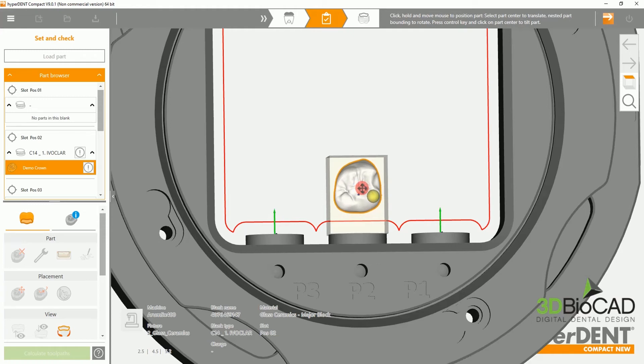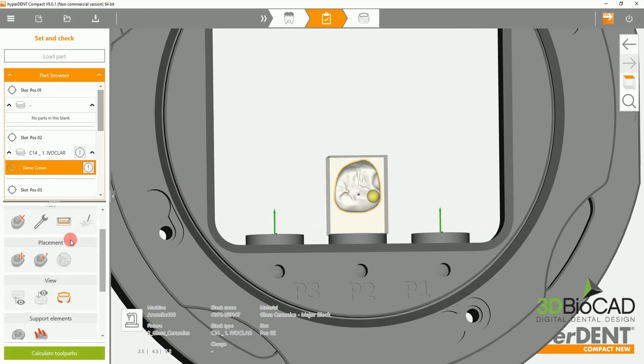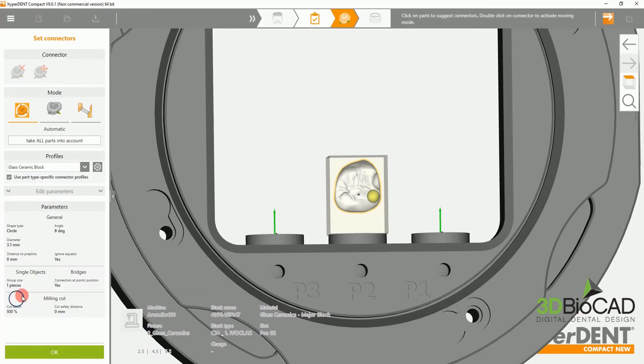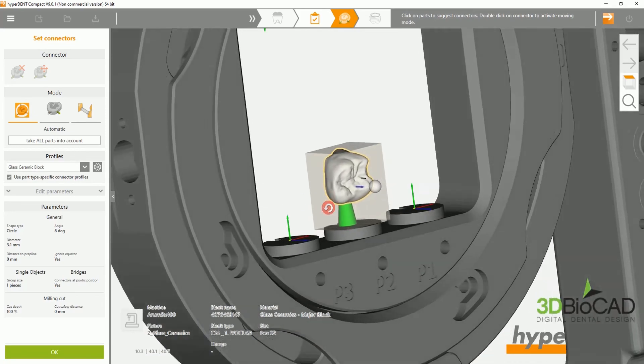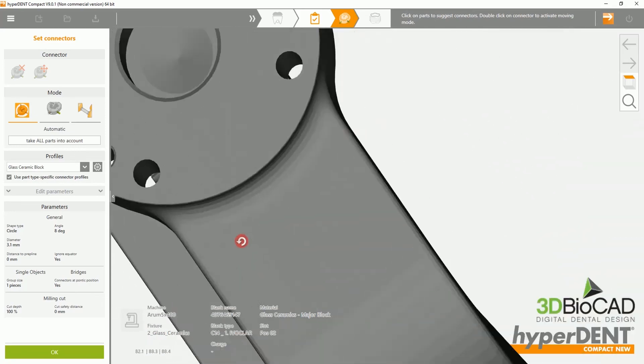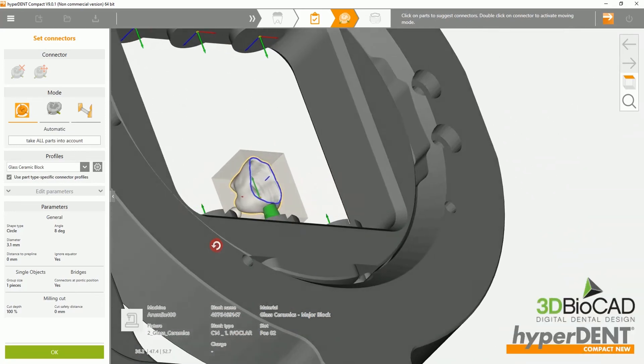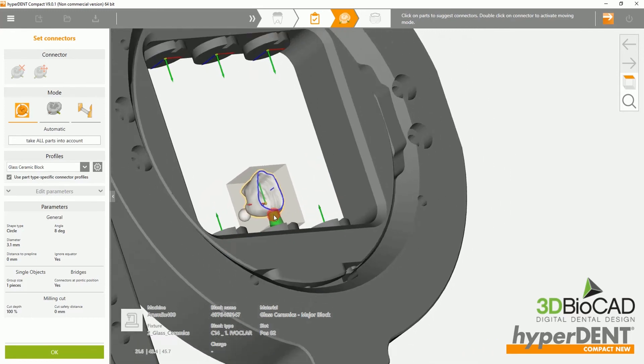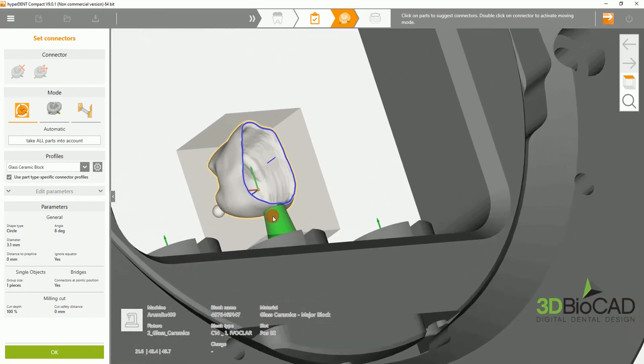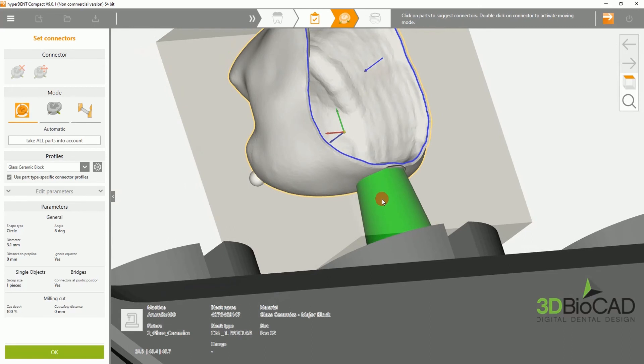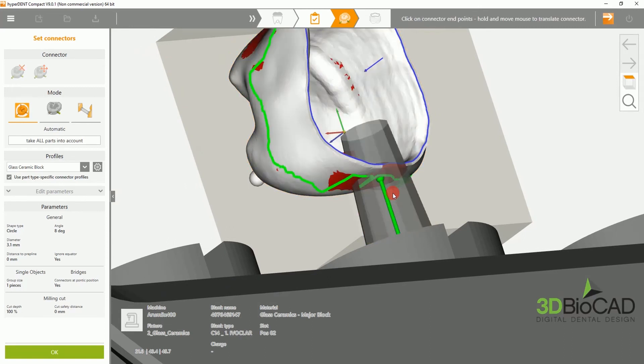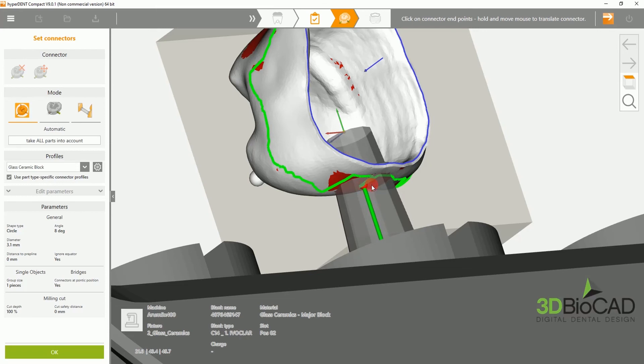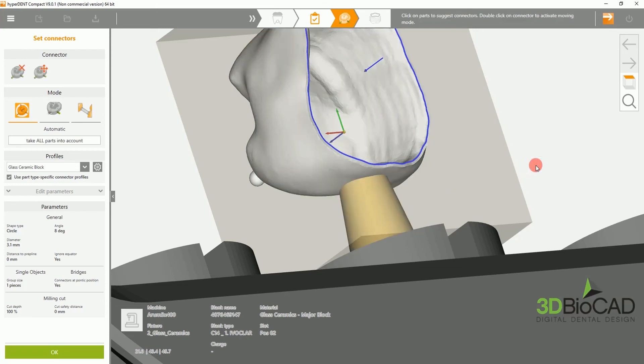Then, we will want to set connectors. To automatically set a connector, please choose the set connector option, then click onto the crown. Please ensure that the connector does not touch the margin. Manually moving the connector not only ensures a clean margin line, but also reduces the amount of undercuts.